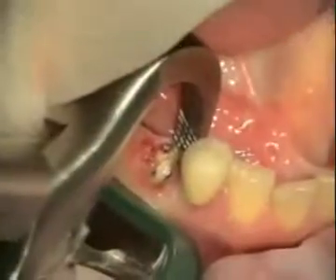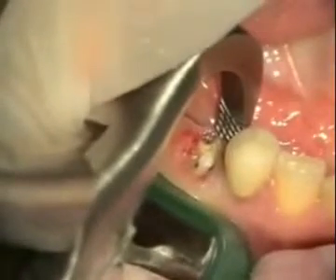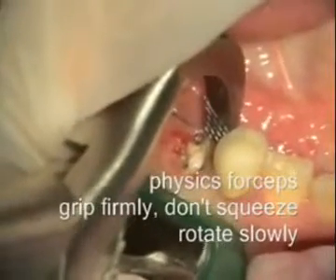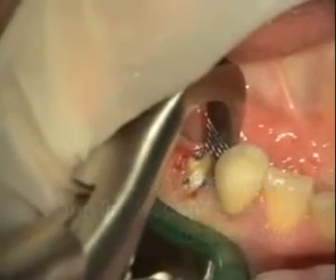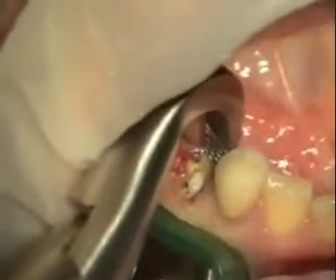Your gum tissue is okay. You're going to feel a lot of pressure in here. You can see where that tooth is cracked — it's just totally cracked in half.